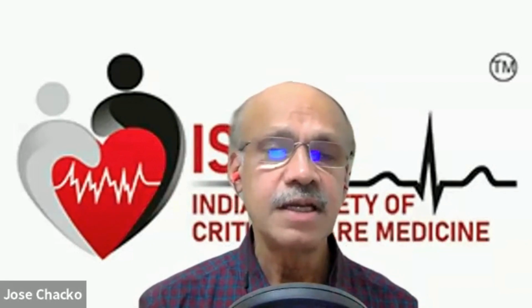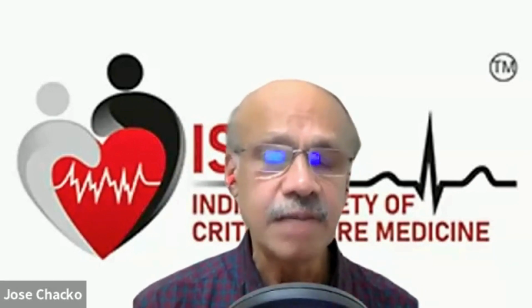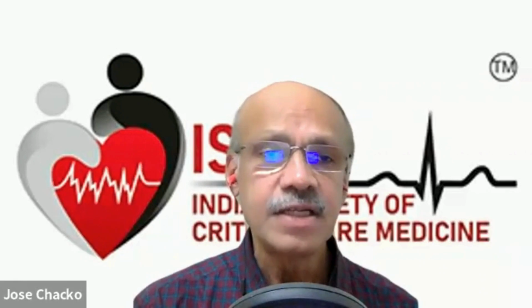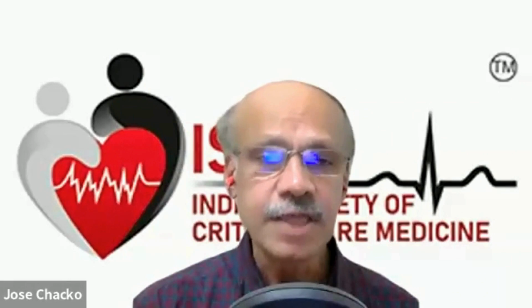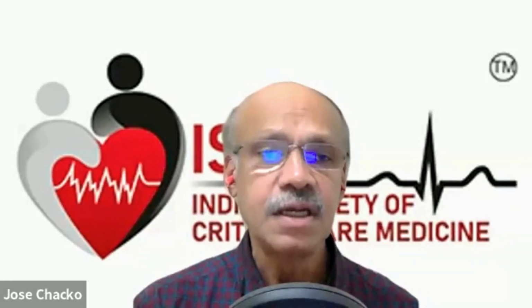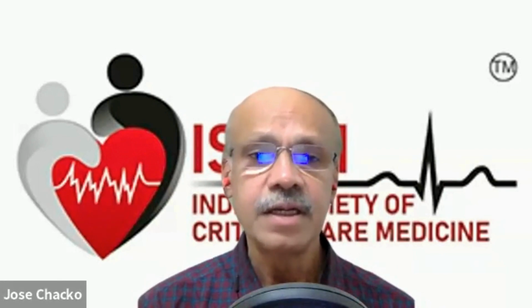So these are briefly the very basic kind of assessment that you do by the bedside in the ICU, a focused examination using echocardiography to assess the type of shock, volume responsiveness, look at the valves, see if there is any major change, mitral stenosis, aortic stenosis, all of which can cause severe hemodynamic compromise, size of the chambers, left ventricular size and function, RV size and function, pericardial effusion, and last but not the least, possible intracardiac shunt contributing to severe refractory hypoxemia.